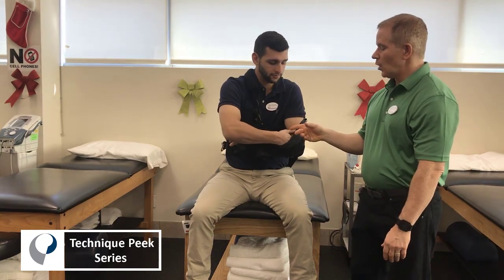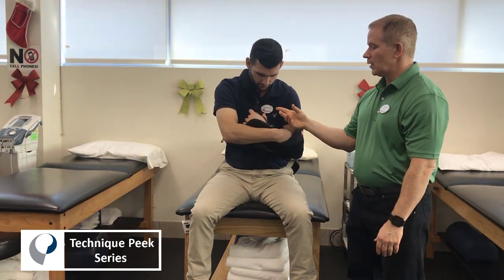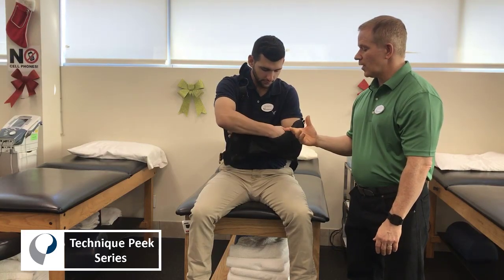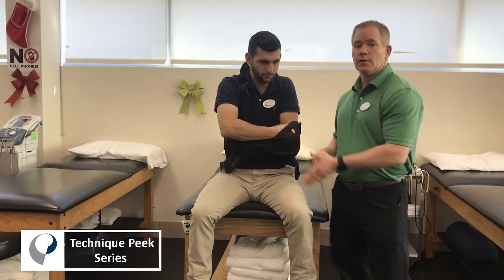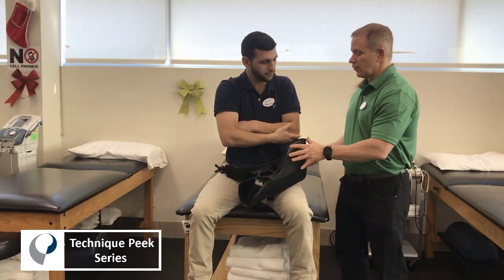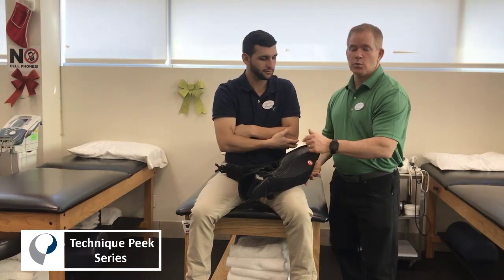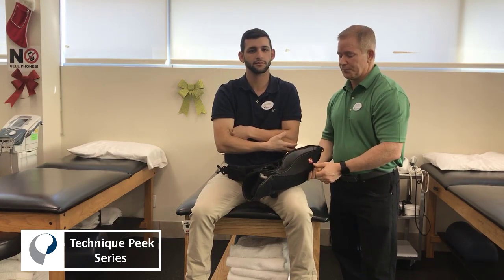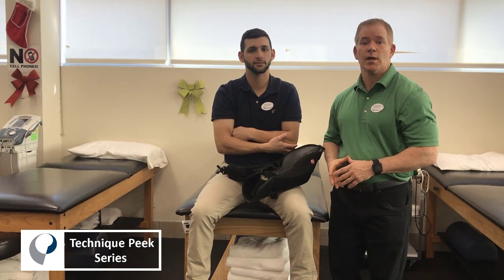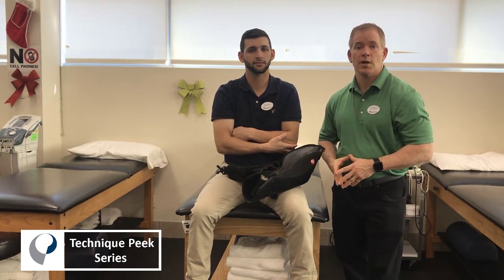The patient can do this by supporting the arm, sliding the hand through the sling, and then unclipping it. Notice that at all times the forearm is being supported, and then very carefully allow the sling to come off from that position. This has been a video on how to safely remove a sling — thanks for tuning in.